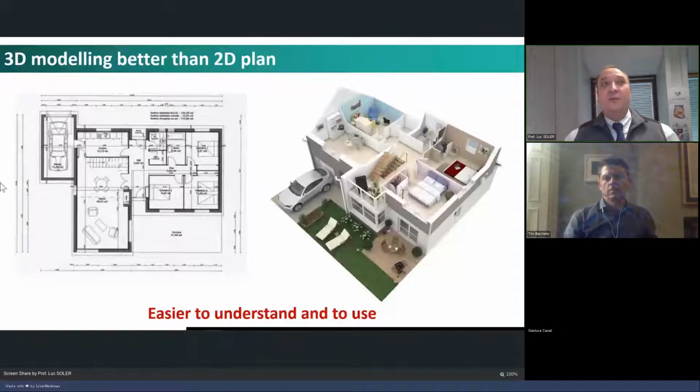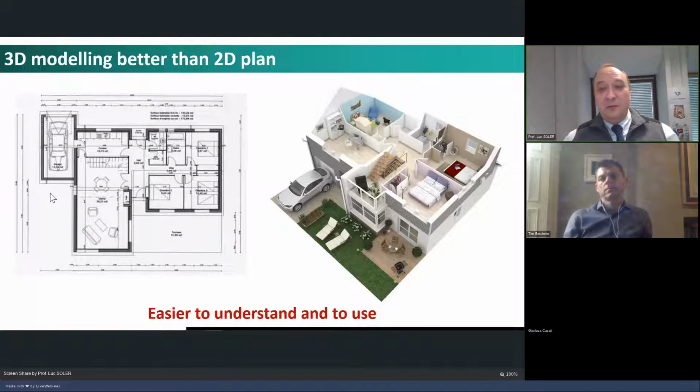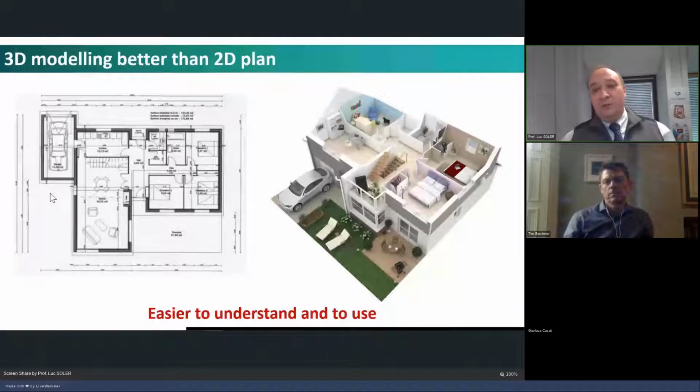And this is one of the reasons why we have such difficulty understanding precisely the 3D anatomy of the patient. And for segmentectomy, it is a major issue, as you will see. You have spoken about segmentectomy. I will speak to you about subsegmentectomy, as you will see, because in reality, segments, like for the liver, you know, I work in a digestive team.